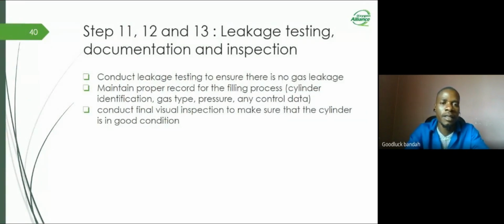These are the last steps after refilling your gas. This involves leakage checking, documentation, and inspection. So after refilling your cylinder, it's good that you do leakage testing. You can do this using a non-oil soap solution to check if you have any leakage.